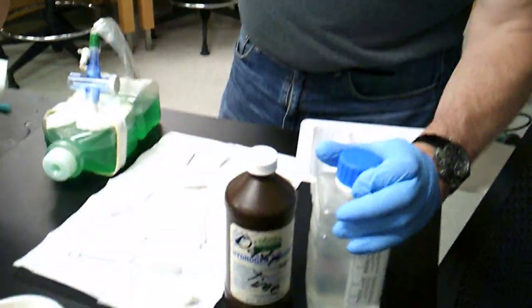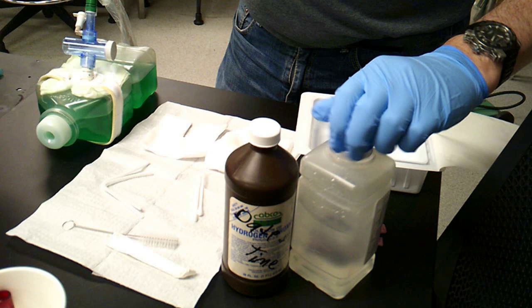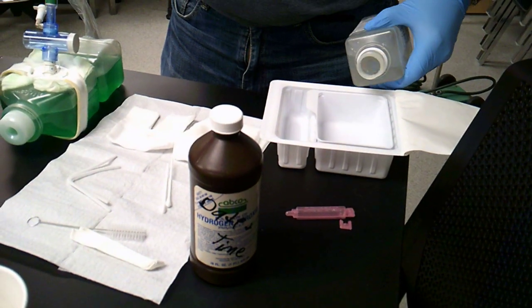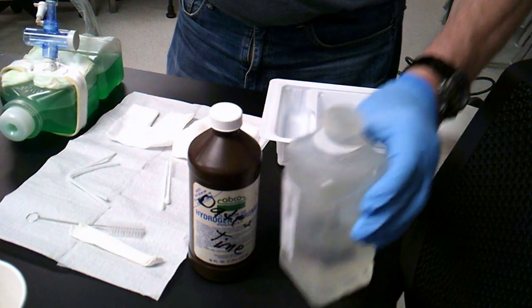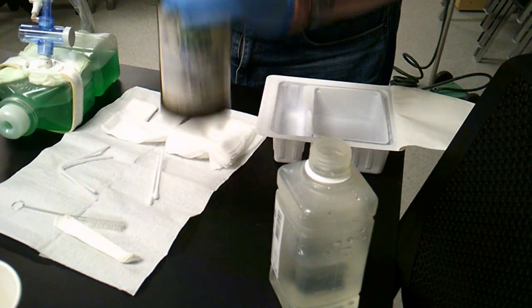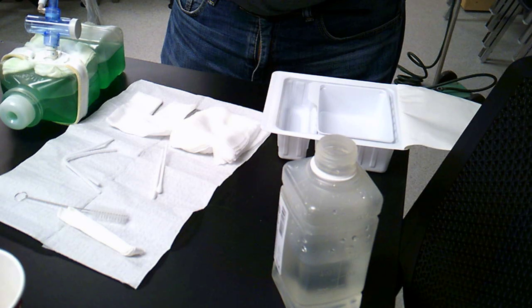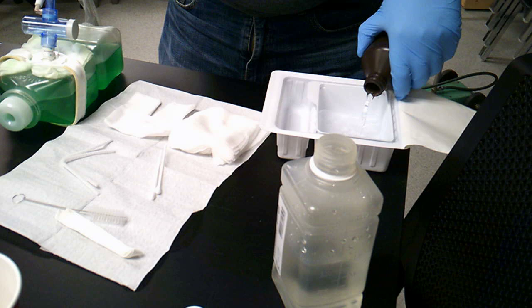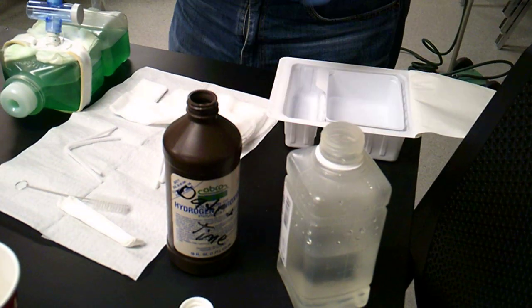And I'm going to open up my peroxide. And I'm going to do a half and half mixture of the two.